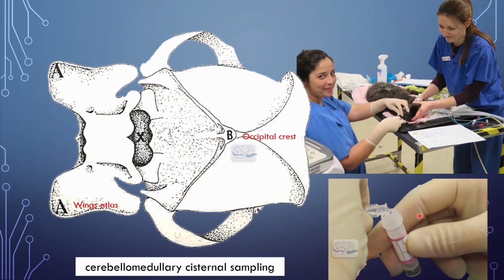And you can see here the placement of the needle and the fluid very gently dripping in. I'm not going to go into too much depth on how to position that needle, really because I think that this is something that should be taught practically and not for a YouTube video.